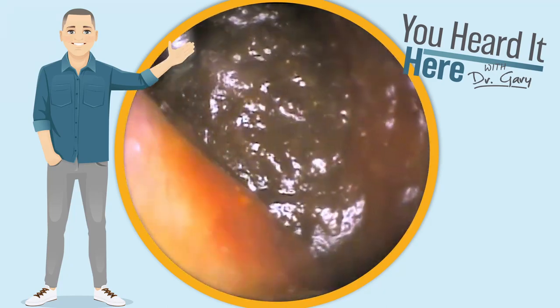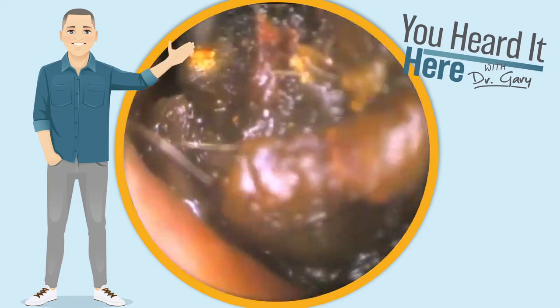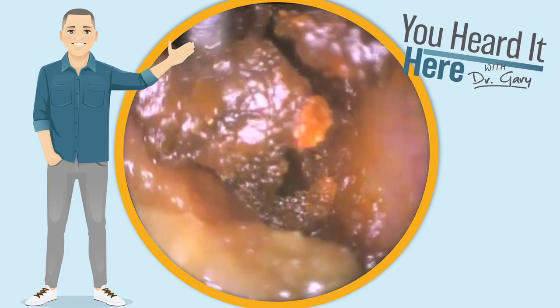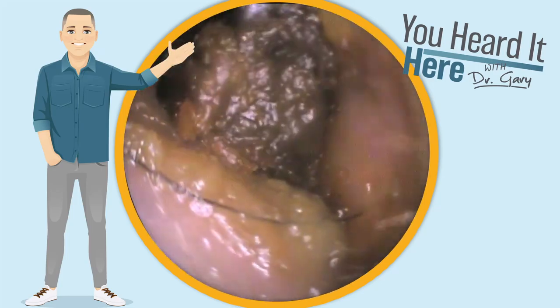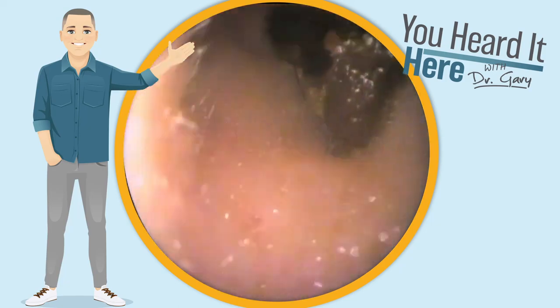Our second patient has wax that is much more soft in consistency. It's not holding together quite as well, and it's also lighter in coloring. Both of these patients are suffering from a severe impaction, but the way we get it out is going to be slightly different.